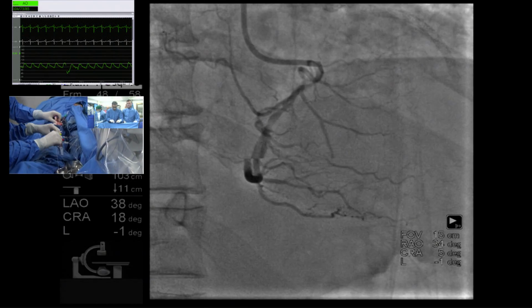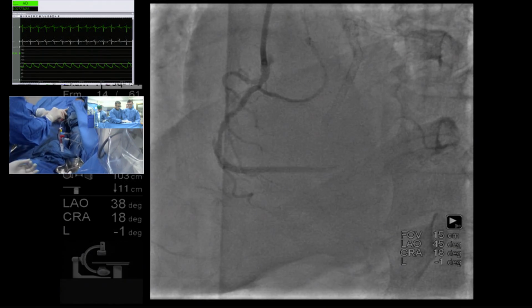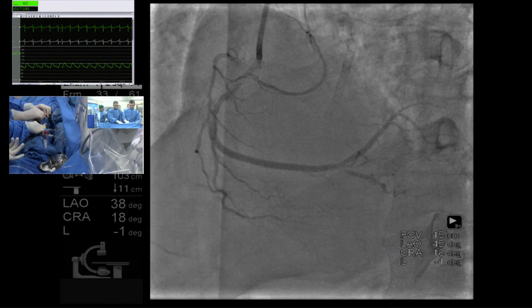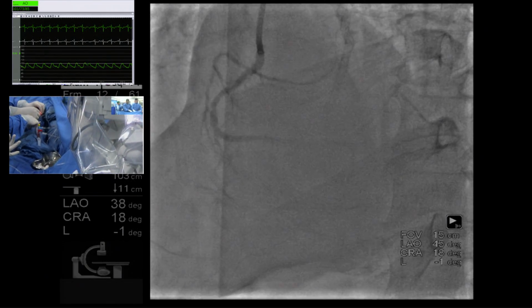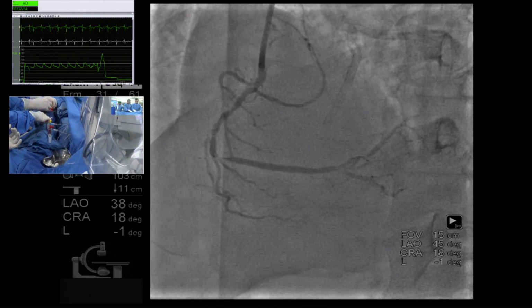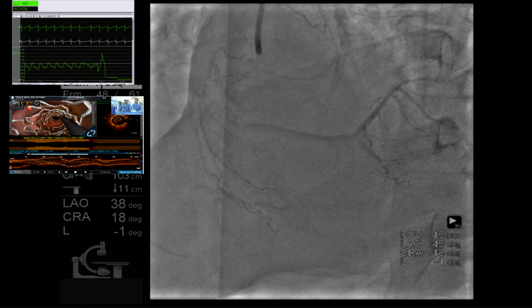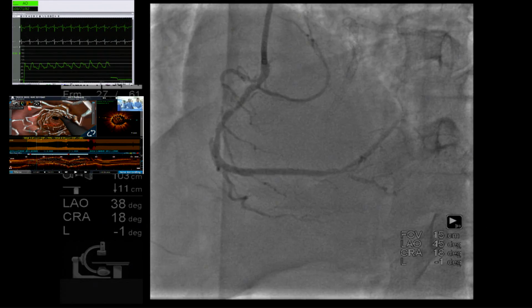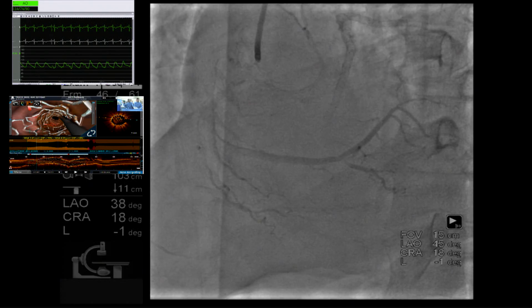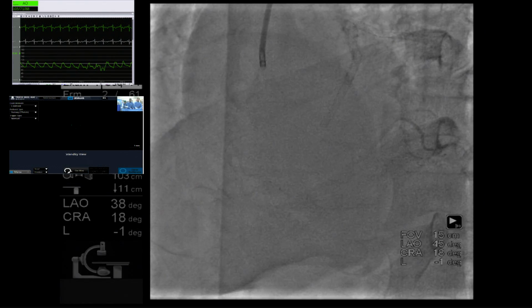So let me ask you prospectively, if there's not much calcium, are you going to direct stent this? It could be a fibrocalcific block, Rajiv. And the other thing is that a friend of mine used to say that he likes to explore lesions with the balloon, to see how the lesion behaves, the lesion length, the size of the vessel. Although we are kind of cheating because we're doing OCT. I was being provocative. I completely agree, Mauricio. I think there's no downside in pre-dilating, right? Because you can always regret.